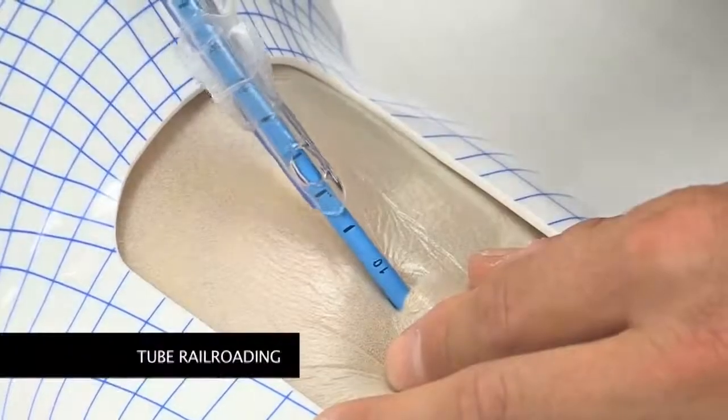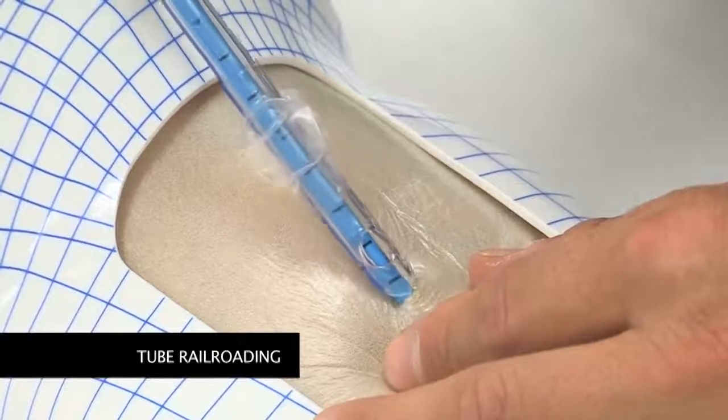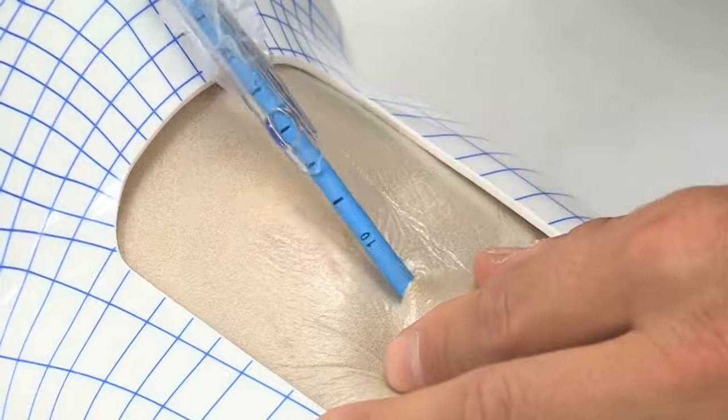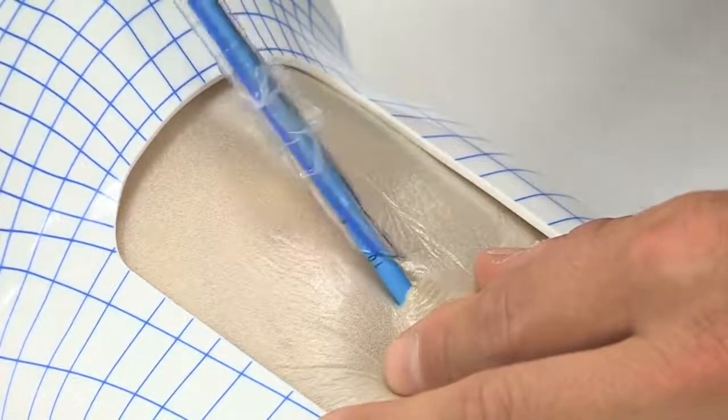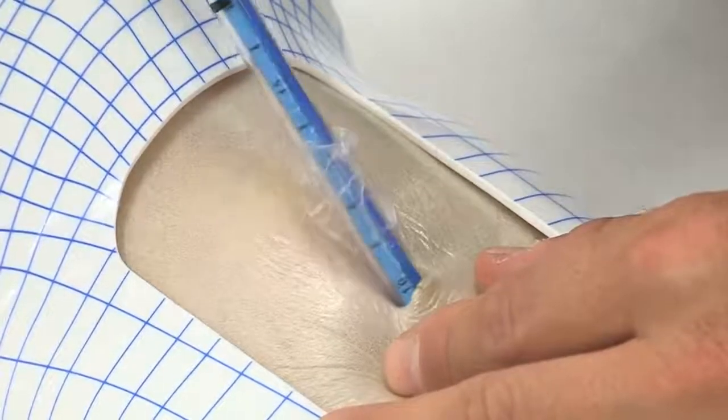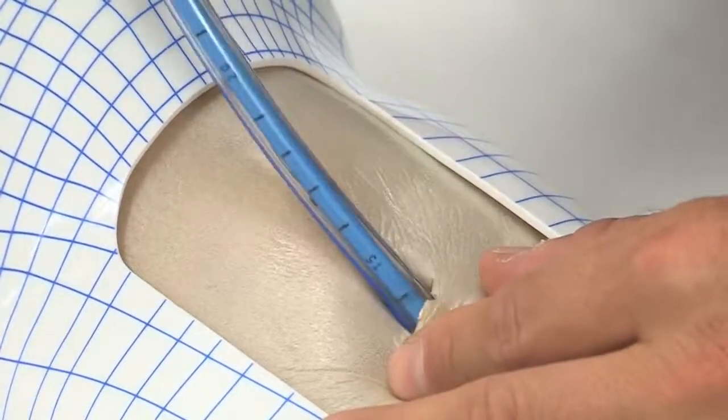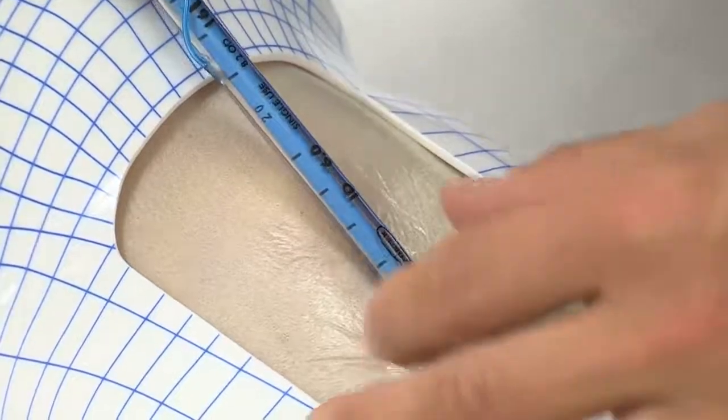Railroading a size 6 tube over the Frova bougie can result in the tip of the tube catching on the skin and subcutaneous tissues. By beginning and continuing rotation of the tube prior to and during railroading, tube insertion can be performed smoothly and safely.